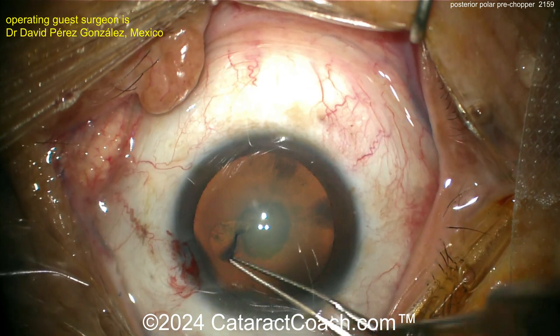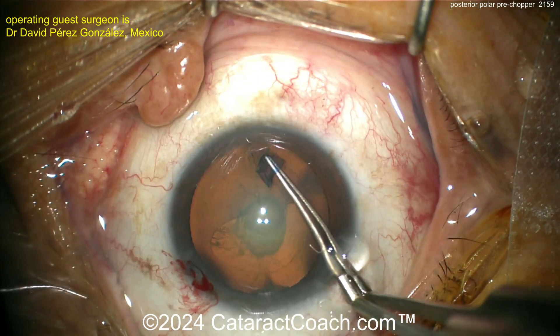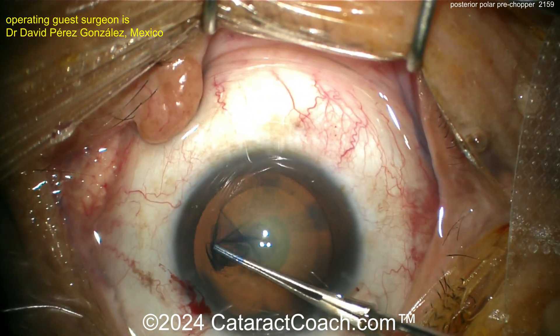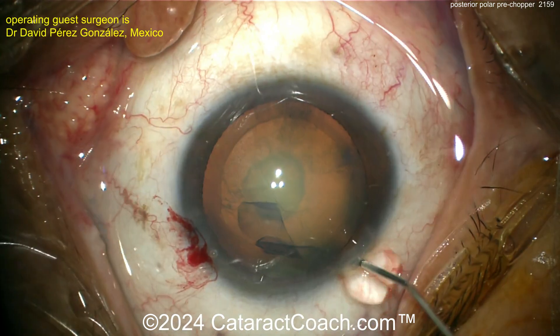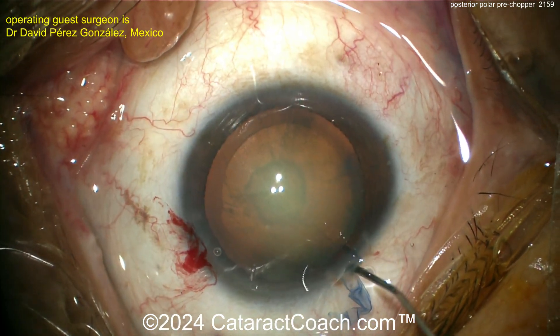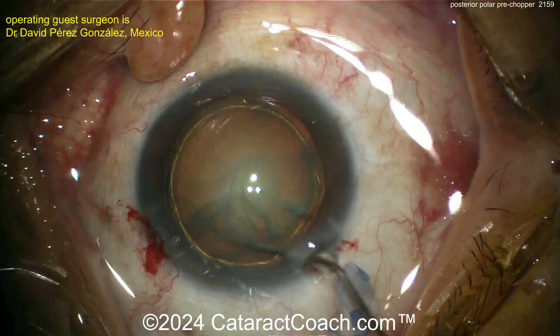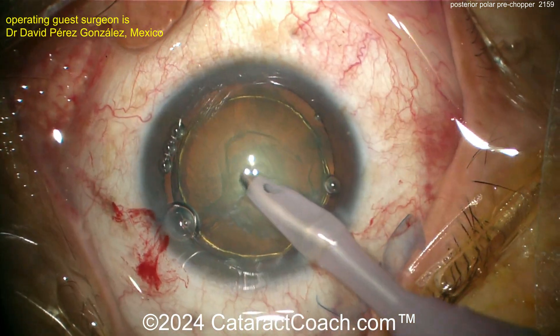Nicely flipped over, now going with forceps and creating a nice rhexis — beautiful looking. The key in posterior polars is we must avoid hydrodissection, because hydrodissection can cause that posterior capsule to split wide open. You can do hydrodelineation instead — there's the golden ring. Now the phaco probe goes in, grooving down the middle.